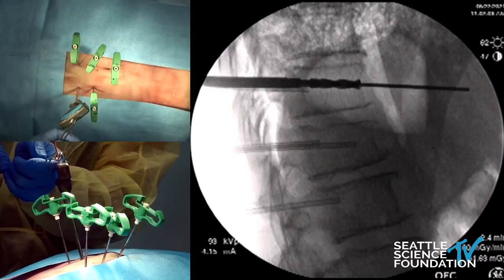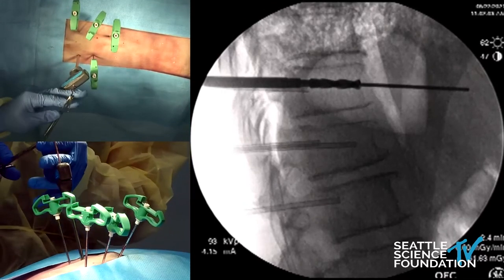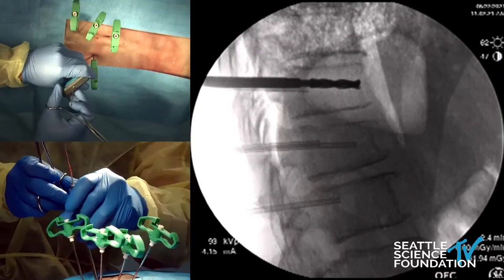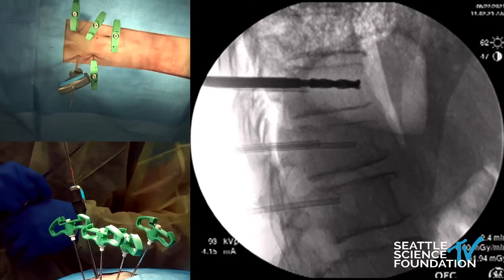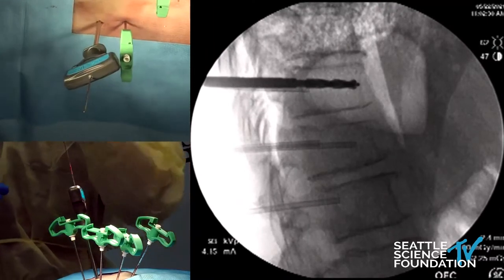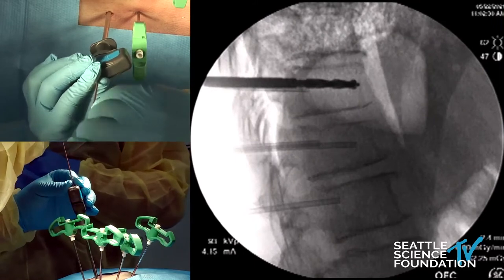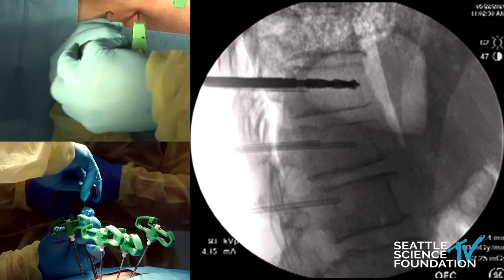We will not be putting any cement on this level. This is a reamer. We'll put some cement in here just to show you what not to do as well. We do want to back that up quite a bit to where we want the spine jack to actually go. Go ahead and remove the wire, and you'll want to remove that inner cannula as well. This is the reamer that's coming out.